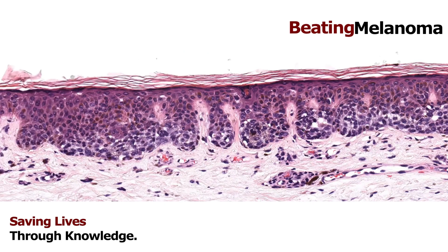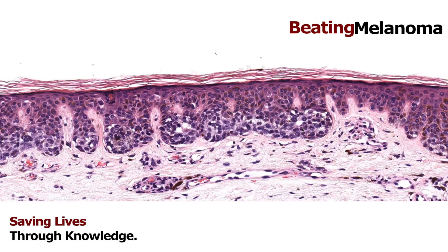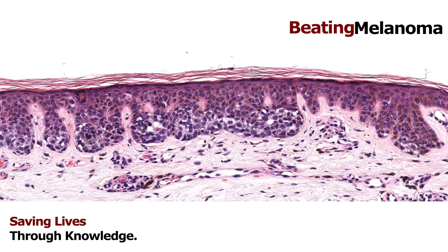Sometimes when melanocytes make nests it's benign — they're just a benign nevus. I didn't pull up an example of a benign nevus to show, but we do see that sometimes where we just have nests of benign-looking melanocytes. There are a lot of different types of nevi and it's actually quite complicated, so let's just focus on the melanoma here.